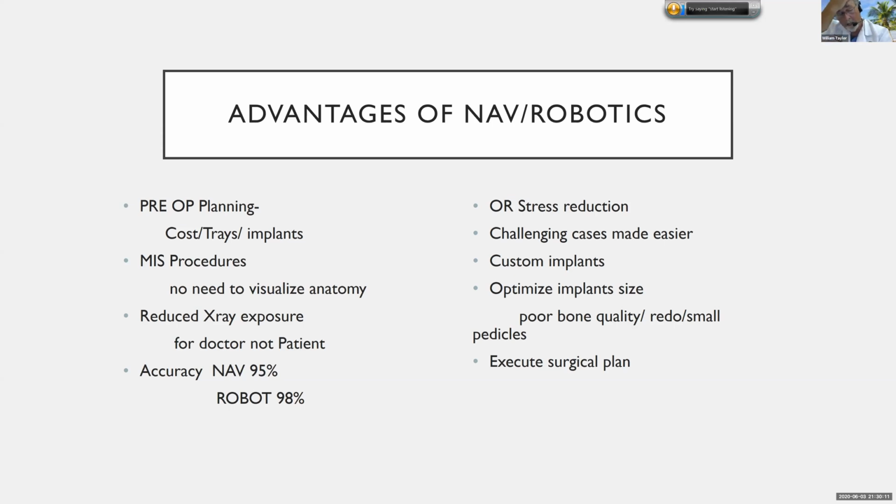My colleague is an open surgeon, but he uses the robot, in this case I'll show you at the end, essentially making a midline incision, going through the fascia in the midline to do his decompression and osteotomies, and then using a separate incision through the fascia and muscle. And he calls this an MIS procedure, so he doesn't have to visualize the anatomy.